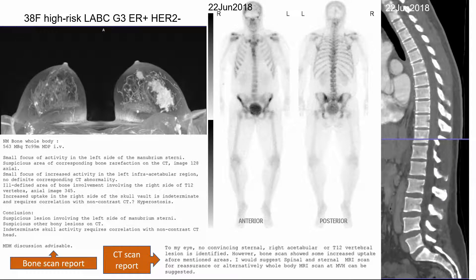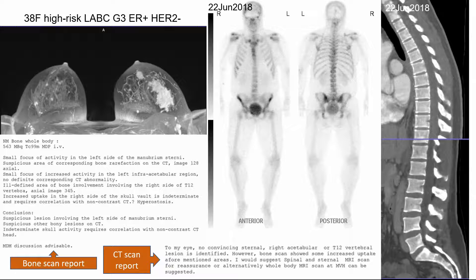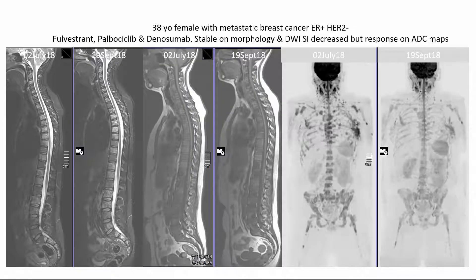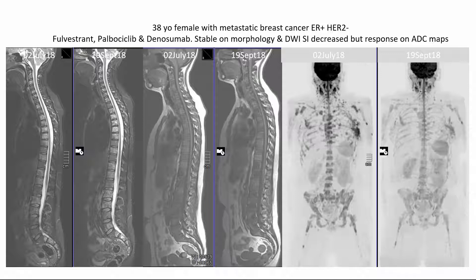Let's take this lady with breast cancer. The bone scan says there are a couple of suspicious lesions. The CT scan says no convincing sternal, acetabular, or T12 lesions are identified. But when you do an MRI scan, every bone has cancer — the CT scan was reported as normal. The reason I show you this is that you can get this quantitative distribution of cellularity, and therefore when you treat it, you can get a changing cellularity. On the morphological sequences there's no change — everywhere in the country, people would say stable. If you did diffusion imaging, you would say response, because the diffusion signal intensity goes down.